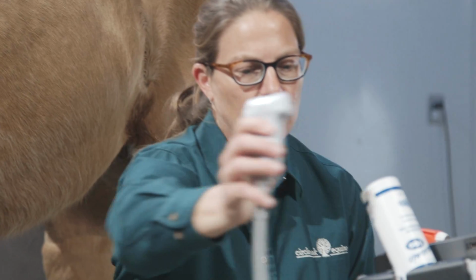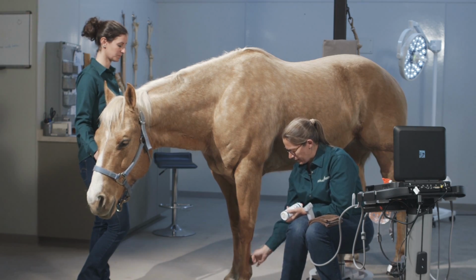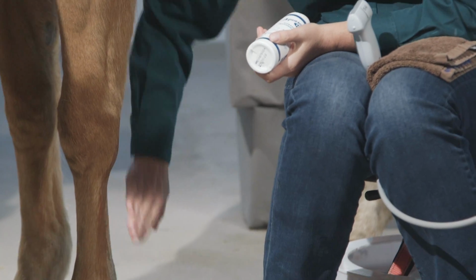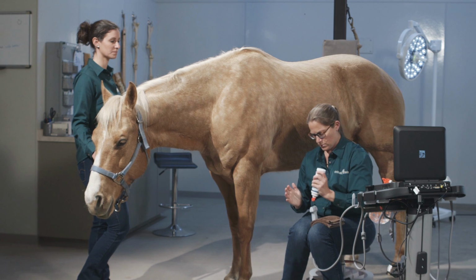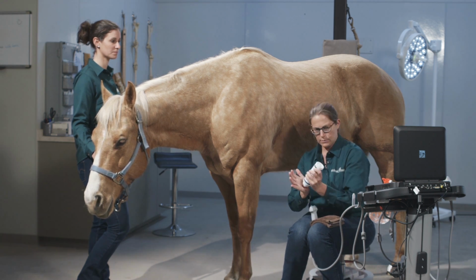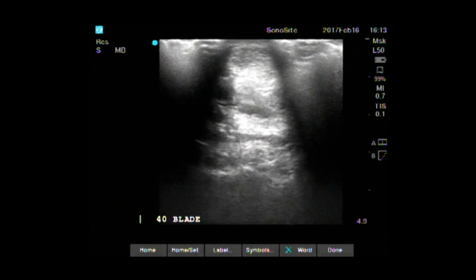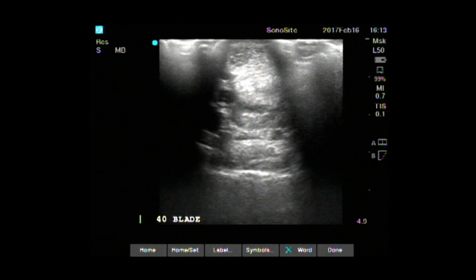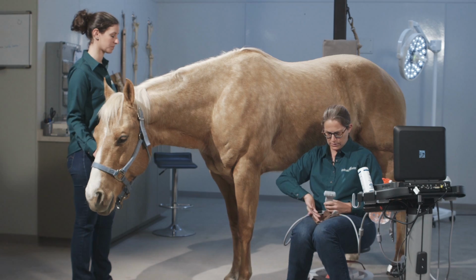We go ahead and start with some gel on the leg and on the probe without a standoff. I put a thin coating of gel on the leg in the clipped area and right to the outside edge of the clipped area. And then I use a little bit of gel on the end of the probe as well. And then I go ahead and assess image quality. Turn the gain up and down, get my depth set. Then I might continue on and scan, or at that point I'll go ahead and assess what the image looks like with a standoff.